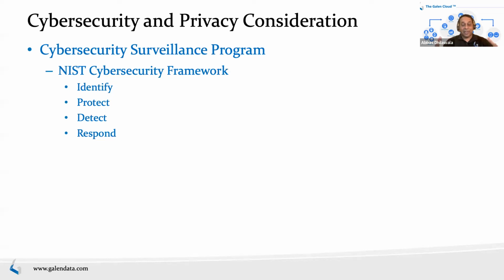Maybe, let's say you have a cloud system, and one of the responses you can have if the cloud system is affected is to set up a parallel system somewhere else and redirect all your devices to that. Or if your device is affected, find a way to quarantine that device. For those kinds of processes for different events or different scenarios, come up with ideas and plans and processes, and assign people: this is your responsibility. Try to have a cross-functional team to do that.